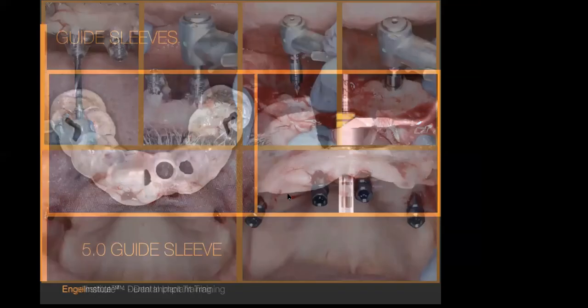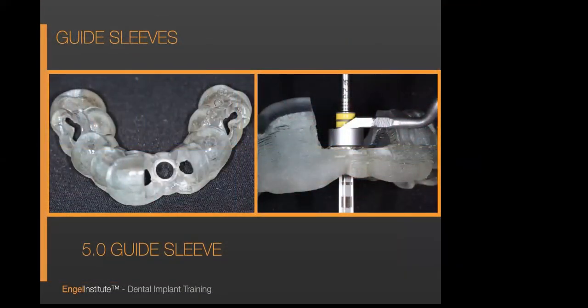Why do I do that? I do that to allow the implant to actually move the bone out of the way. So the implant is doing like an osteodensification, where it's actually moving the bone out of the way. So I always say, push it like an accordion versus drill it out. So we're actually compressing this type 3 or 4 bone into type 3 or 2 bone, which is really conducive for the implant's survival, or help anyway. So those are a couple of reasons that I would do a pilot sleeve, okay?